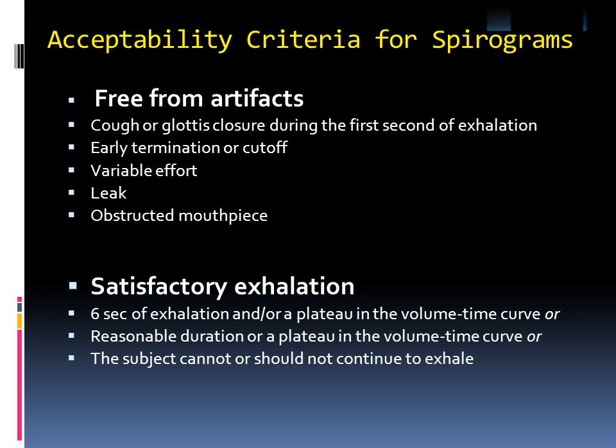Acceptability criteria for spirograms. Free from artifacts. Cough or glottis closure during the first second of exhalation. Early termination or cut-off. Variable effort. Leak. Obstructed mouthpiece.